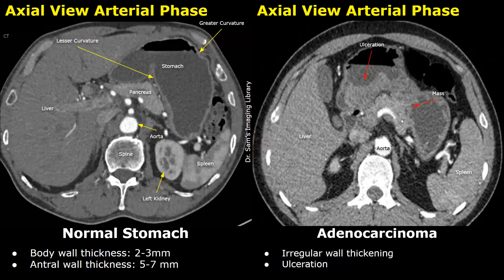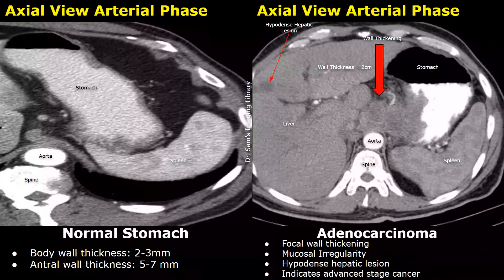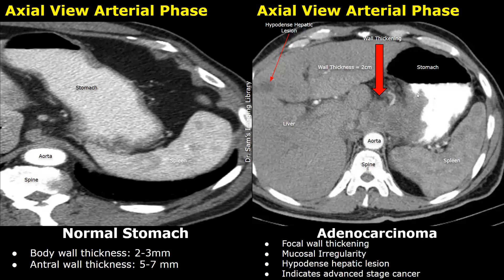In this image we can see a large irregular mass enhancing with intravenous contrast medium, with a crater-like concave-shaped defect representing ulceration. An abnormally increased thickening of the gastric wall indicates deeper invasion into the stomach's muscular layers, and evidence of fat stranding or enlarged lymph nodes indicates cancer spread beyond the serosal layer. In this image the irregular stomach mass measured two centimeters, and along with this mass there was a hypodense lesion in the liver, which was metastasis of the gastric carcinoma into the liver.